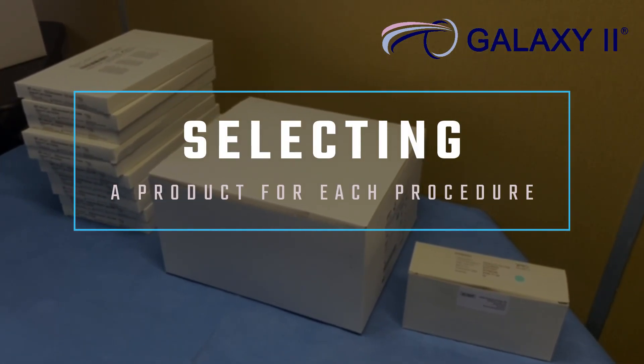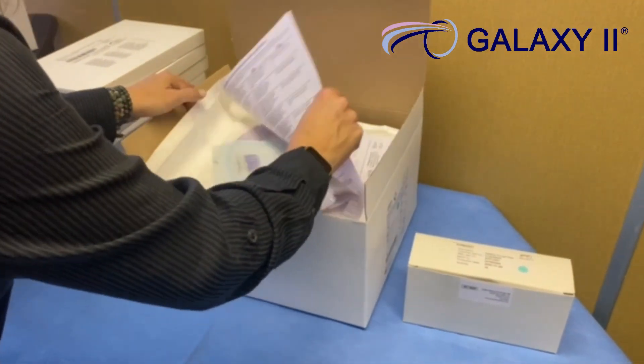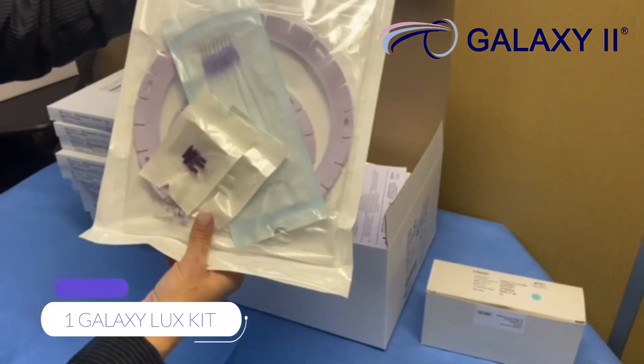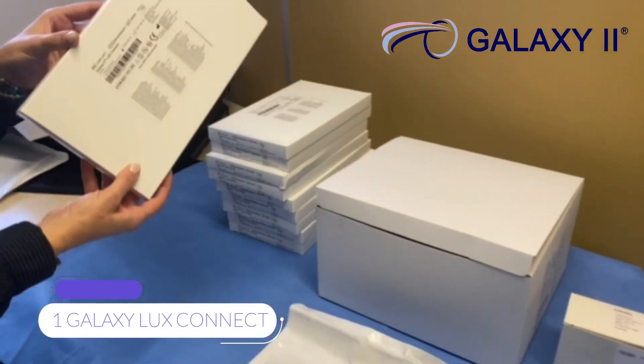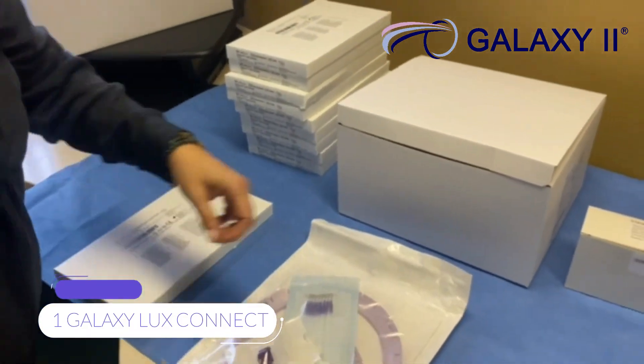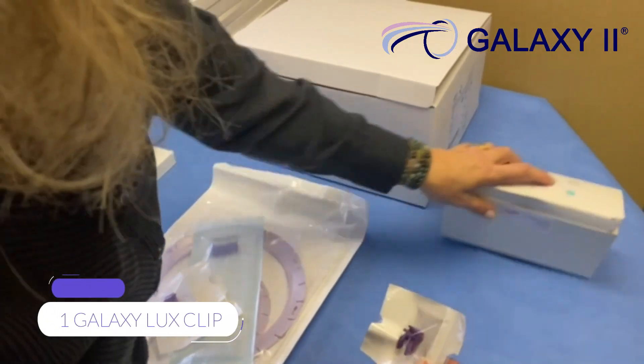Selecting your product for each Galaxy Luxe procedure: you will need one Galaxy Luxe kit, one light, and one Galaxy Luxe clip.